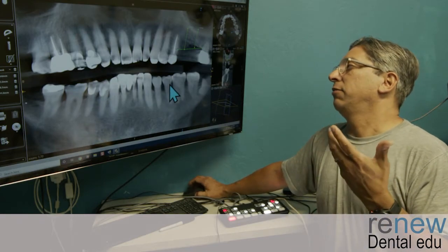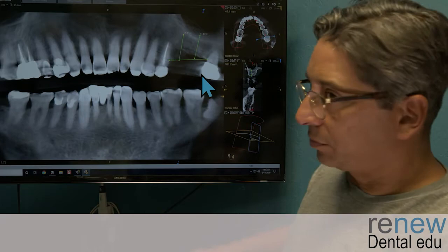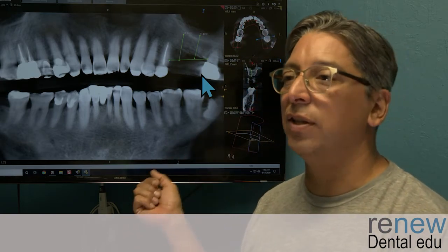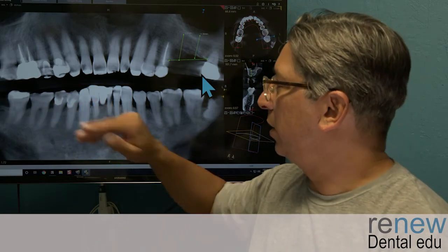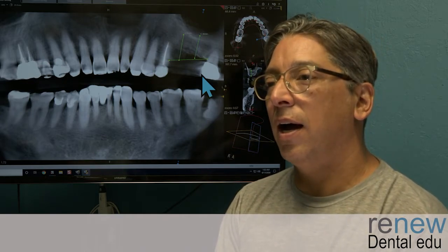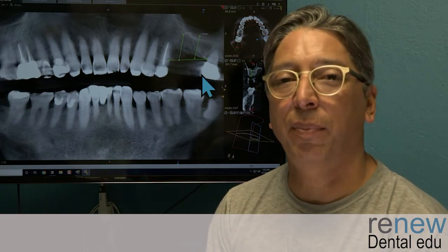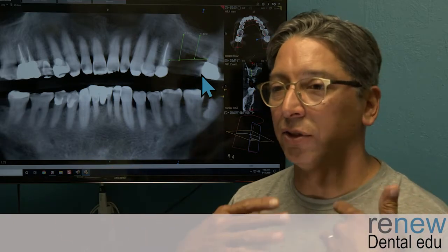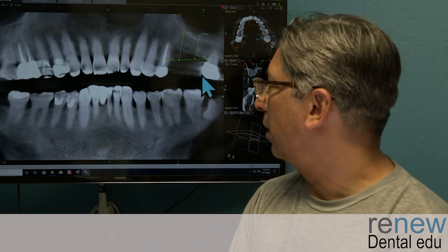So here's a rare opportunity where I actually feel like I would be placing a second molar implant, because the patient is not restoring that upper left side with implants, and I feel it's a financial situation. Getting him to invest in 1 implant is one trick. Getting him into 2 is nearly impossible. So we'll see in the future if this patient comes back after learning a little bit more about that front zone. I suspect if the doctor takes care of that for the patient at no charge, the patient will be fine and just kind of move on. But that is a problem.